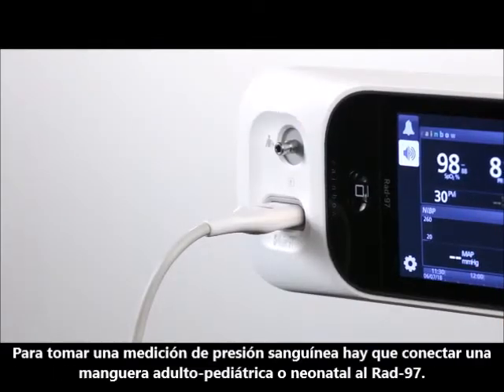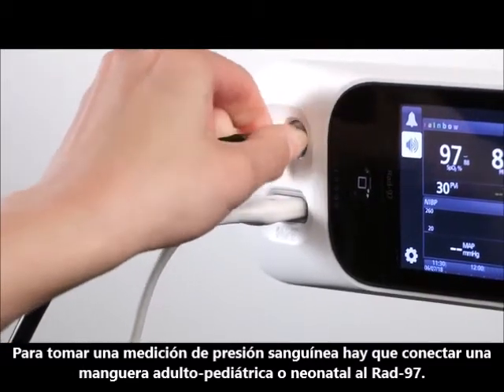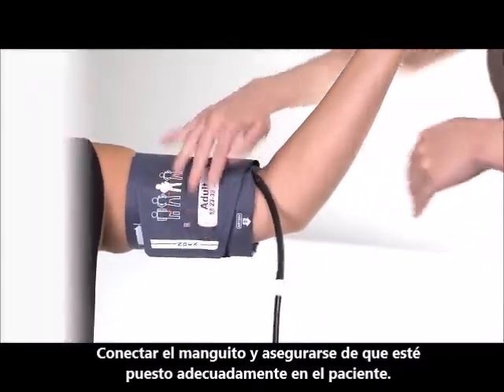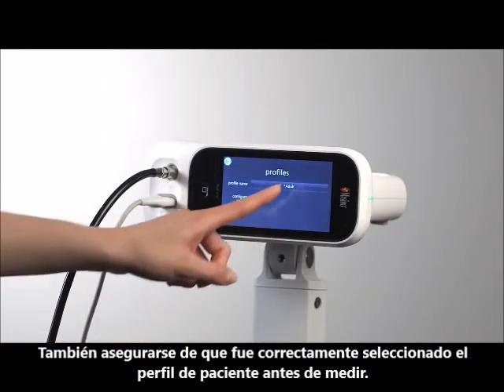To take a blood pressure measurement, connect an adult and pediatric or neonatal blood pressure hose to RAD97. Connect the cuff and ensure the cuff is placed properly on the patient. Also ensure the correct patient profile is selected before taking a measurement.